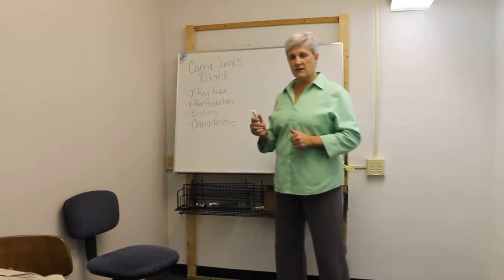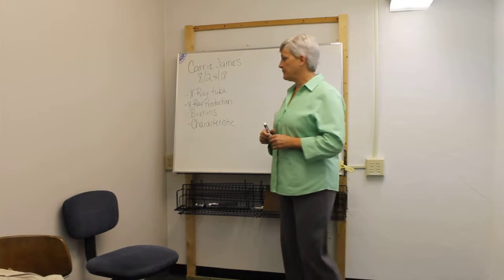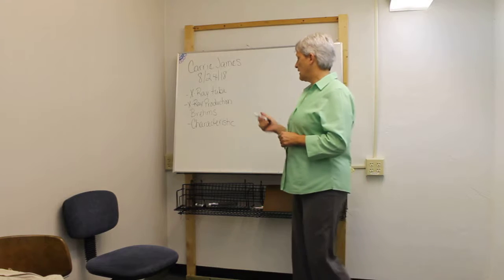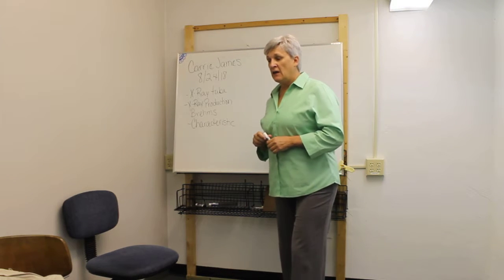Hi, I'm Carrie James. I'm interviewing for the radiology instructor position. I'm going to be talking today about the X-ray tube, X-ray production, and Bremsstrahlung and characteristic radiation.